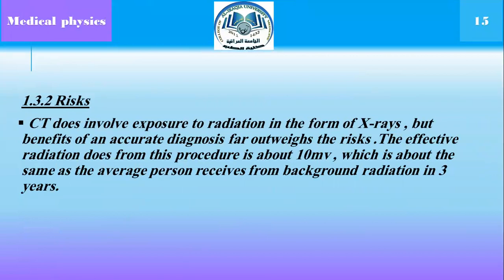CT scan does involve exposure to radiation in the form of X-ray, but the benefit of an accurate diagnosis far outweighs the risk. The effective radiation dose from this procedure is about 10 millisieverts, which is about the same as the average person receives from background radiation in 3 years.